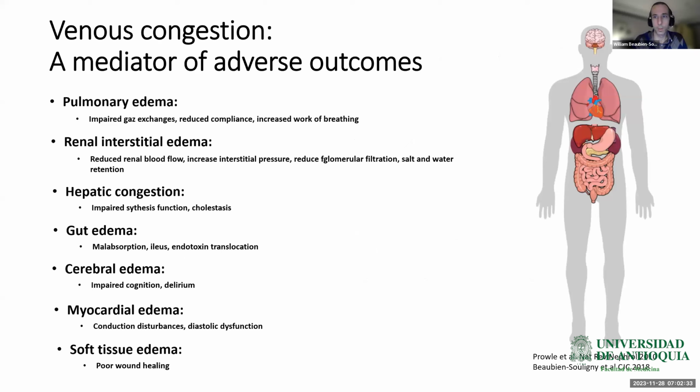In this study, there was 1 month follow-up of these signs, mostly after discharge from the hospital. As you can see here, these abnormalities can be found in heart failure with preserved ejection fraction, heart failure with moderately reduced ejection fraction, and heart failure with reduced ejection fraction.